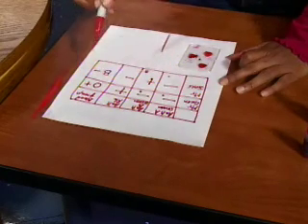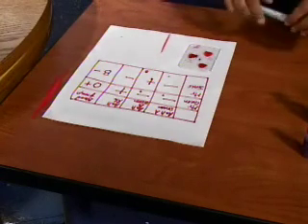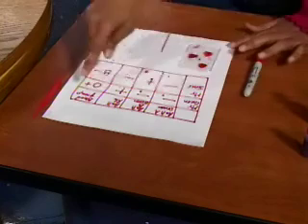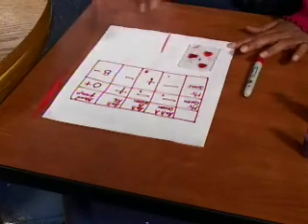So this is how you determine blood groups, and this is the activity that you'll be doing in the lab, where you'll be given the serum and you'll be given unknown blood group, and this is the principle behind typing the blood groups.